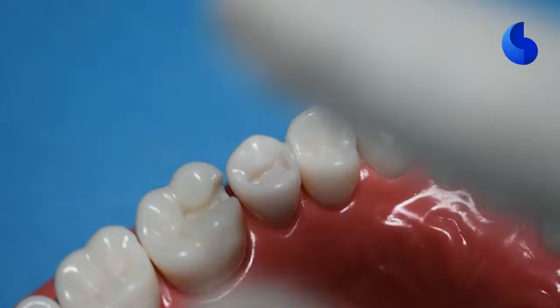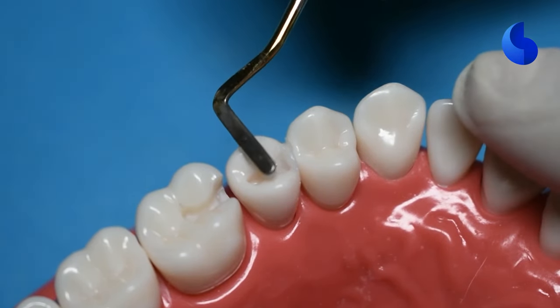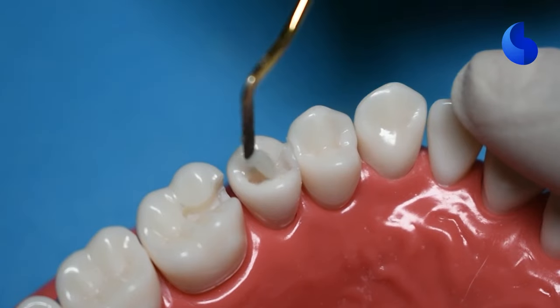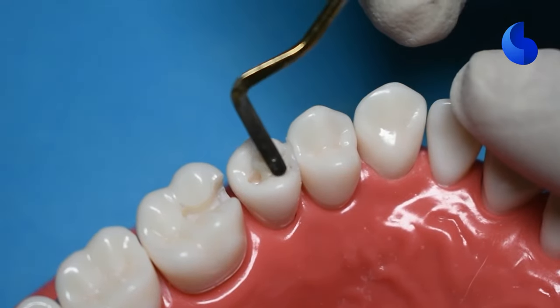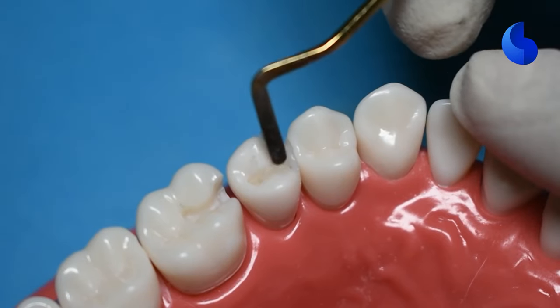I'll go ahead and use our plastic instrument to add some more composite into our occlusal surface. This is a simple class one that we all can handle. Condense it to the walls.